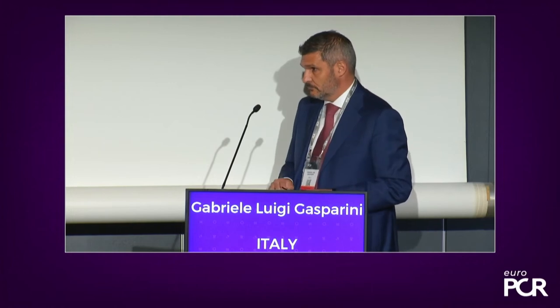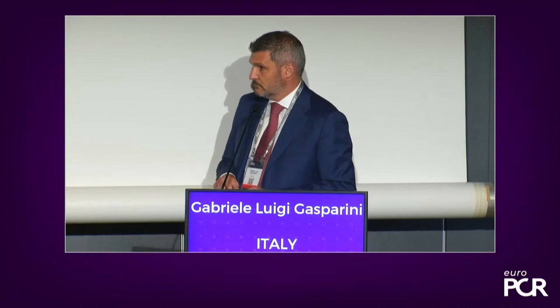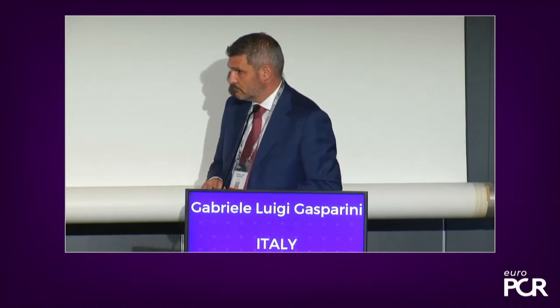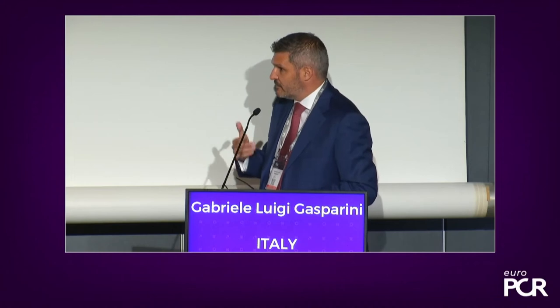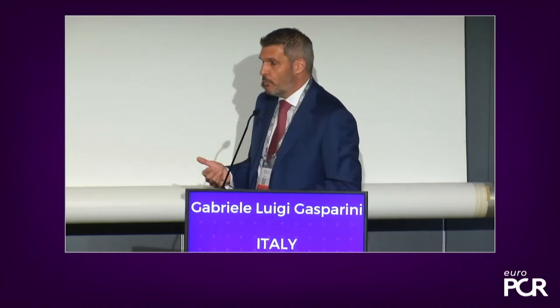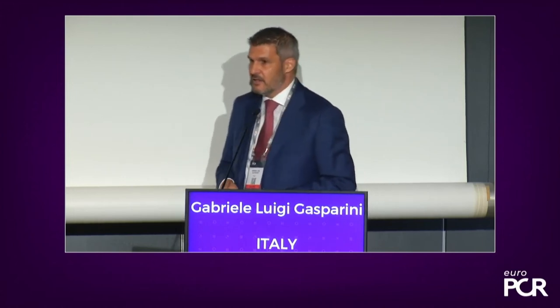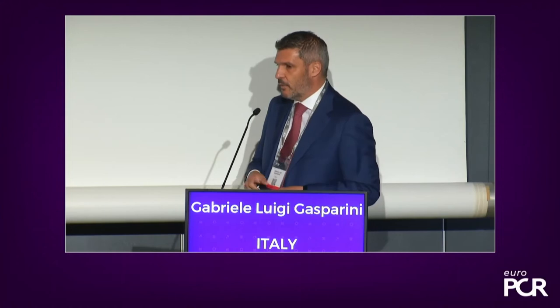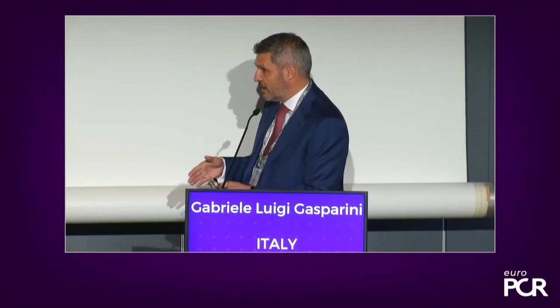So, Gabriele, just one important question. The scenario that we often face is that we cross with the wire almost intraplaque, but no device can follow. So what's your algorithm for the device uncrossable lesion? Yeah, of course. First of all, to improve the support, but maybe I already started with the right setup, so with a supportive guide or a guiding catheter extension. But if even in this case the device cannot cross, I try, as I explained, some technique with the balloons, low profile balloon, the wedging or the grenadoplasty.